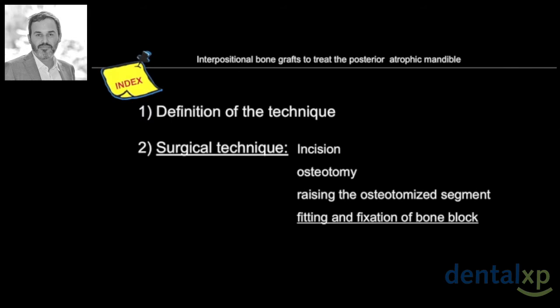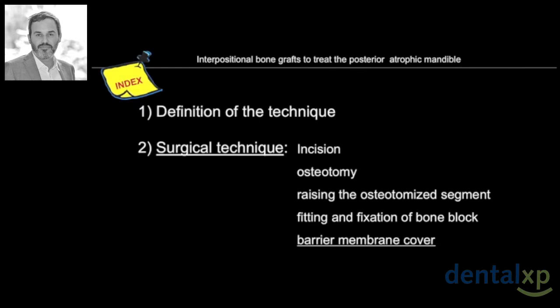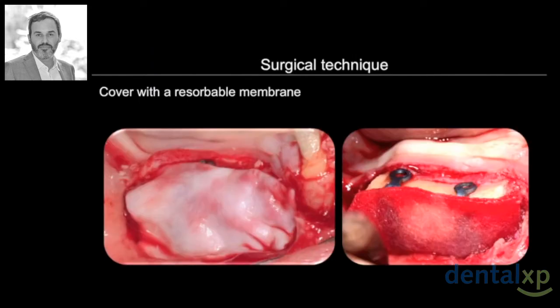At this point, in the space obtained, the material is positioned. Then, fix everything, because at the end, it is needed to stabilize everything with the titanium mini plates. And lastly, cover with a resorbable membrane.